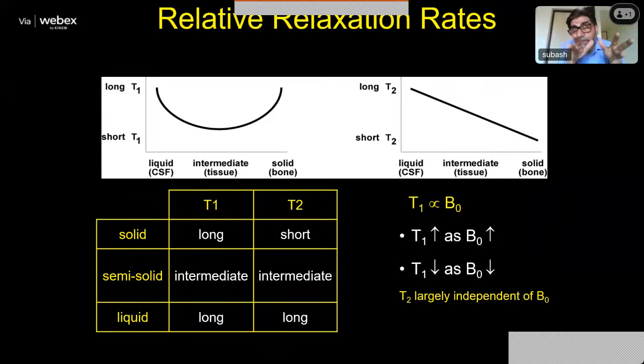So there were a lot of difficulties in creating T1 contrast in MR imaging systems when people shifted from 1.5 Tesla magnets to 3 Tesla and 7 Tesla. The T1 contrast mechanism became quite difficult, and people had to work hard to set these contrast mechanisms right by trying out different pulse frequencies. The inversion recovery pulse sequence became famous for this purpose, and many more changes were made so that T1 contrast images can be produced in a nicer way.